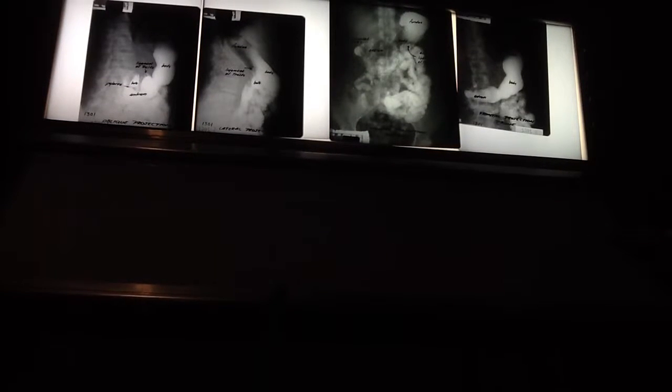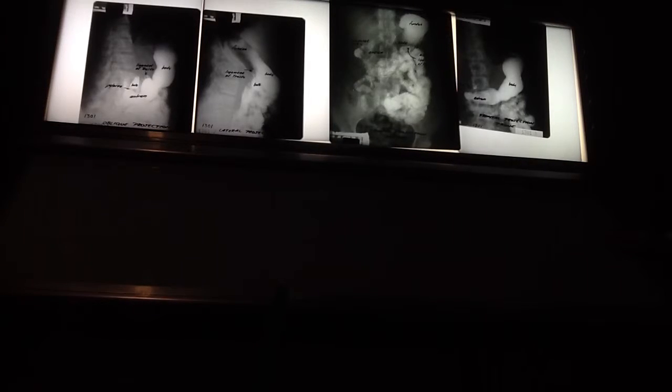In today's world, very often you will see one of two things. You'll either see a helical CT. Do you know what I mean when I say that? That's the one where it just keeps going around and around and around, the patient just slides through.